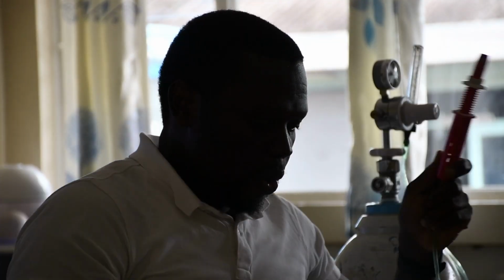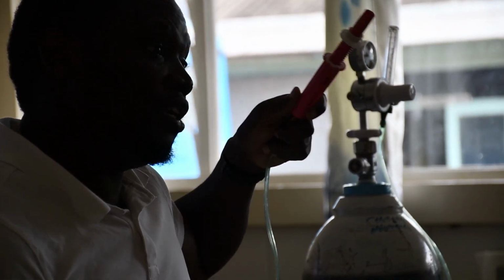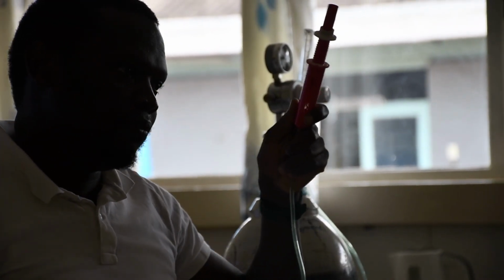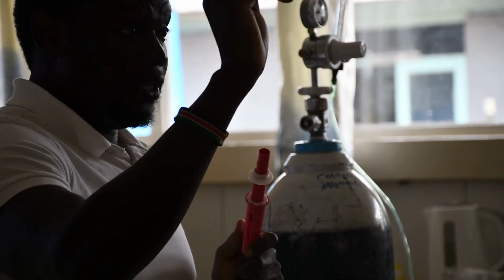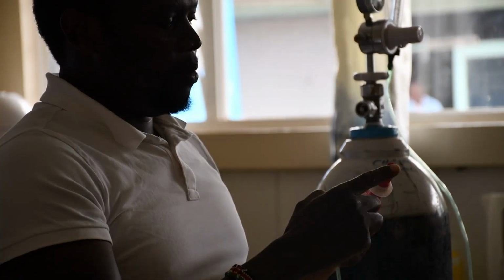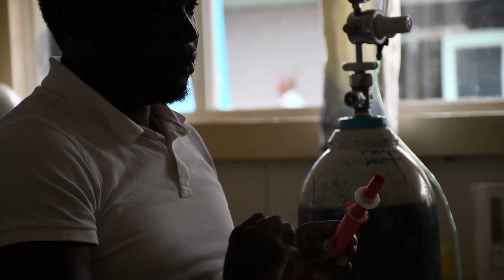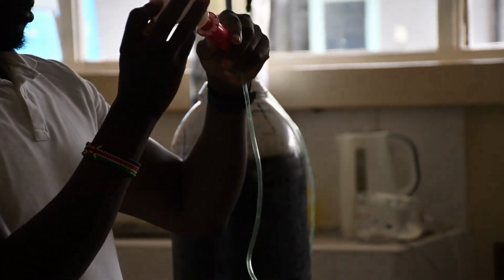Okay? So what we want to do, we want to still make sure that the neonate receives safe levels of gases. Okay? So that's why you want to do what? You want to filter whatever is coming. So the filter becomes the immediate next after the blender. The filter only goes in one way.